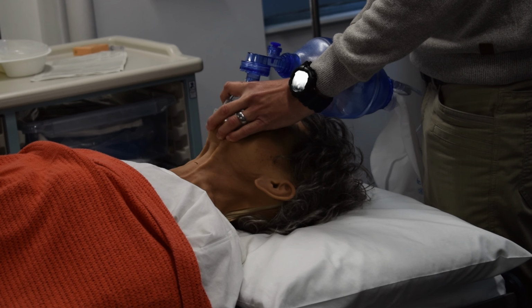They've done studies on this, and they found that when they used the modified jaw lift, they had better tidal volumes. This was done in theater, so it was in a very controlled environment. But I think there's a lot to take from that, I feel. Definitely something that I'm going to consider.